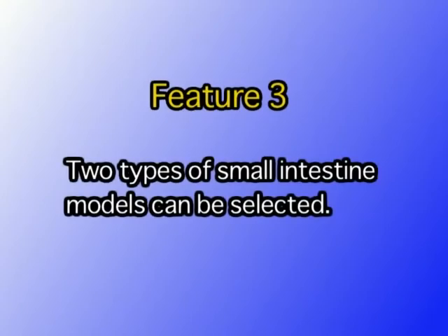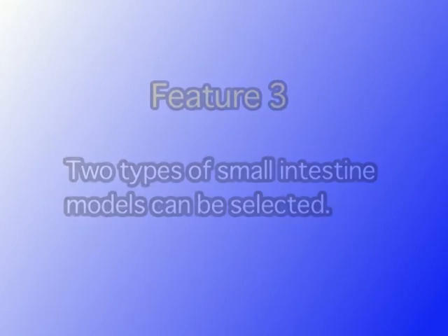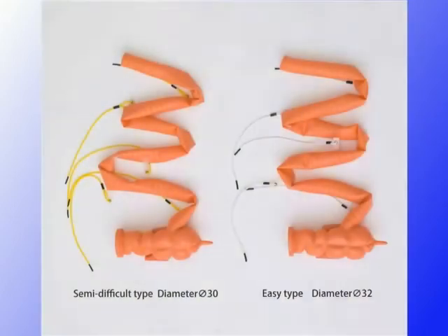Feature 3: The small intestinal model can be selected to match the level of the trainee. A semi-difficult type or easy type can be selected. In the future, the level of difficulty of each intestinal model will be changeable.